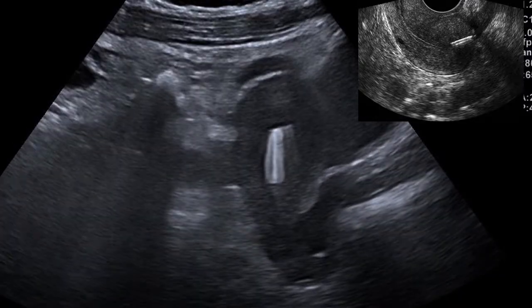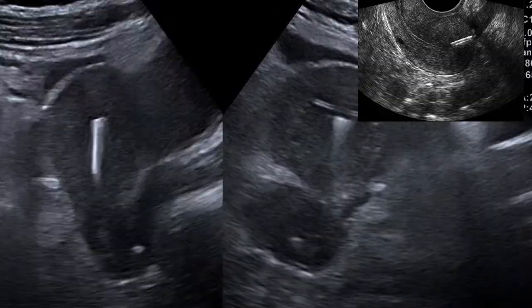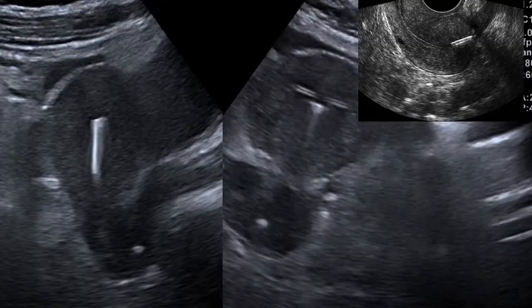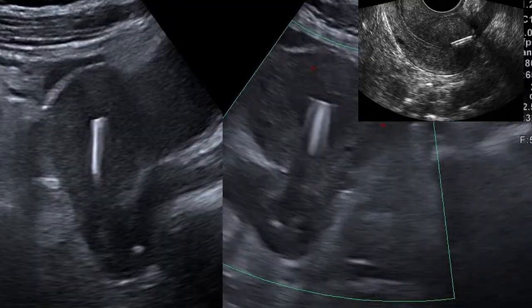So now when you're writing the report, you must indicate that there's no sonographic evidence of malpositioning, embedment, perforation, inflammation, or pelvic inflammatory disease. So those ones you should always write in your report.